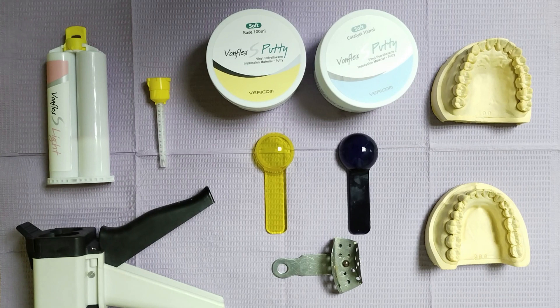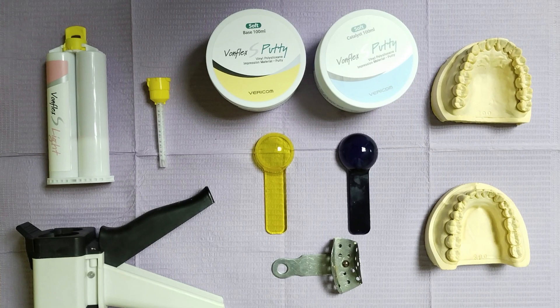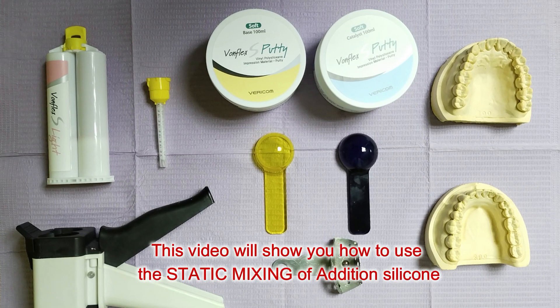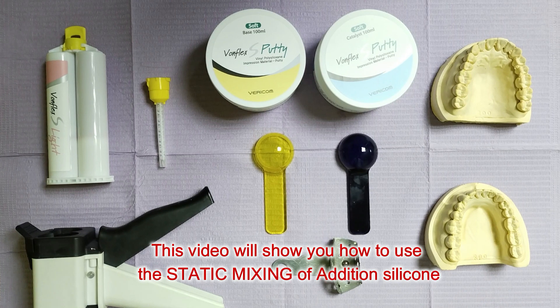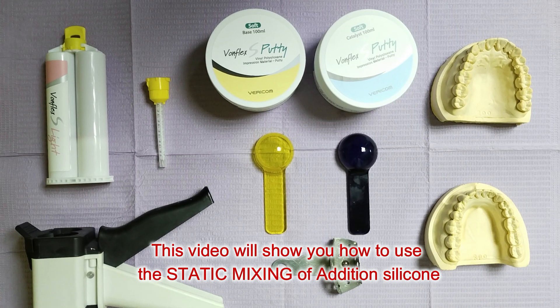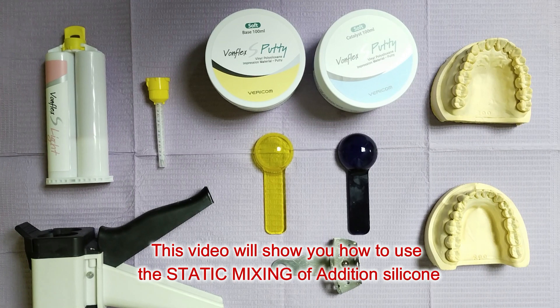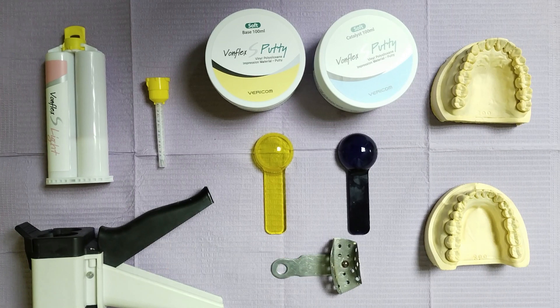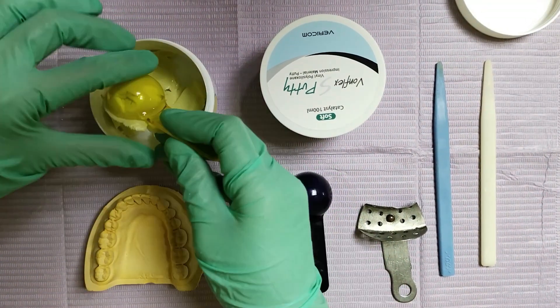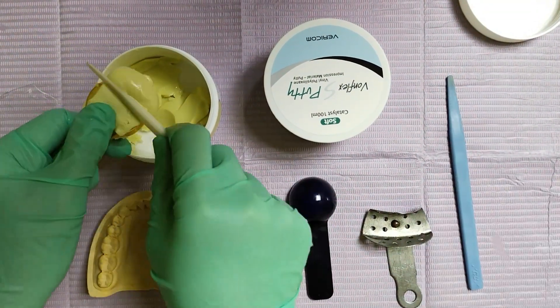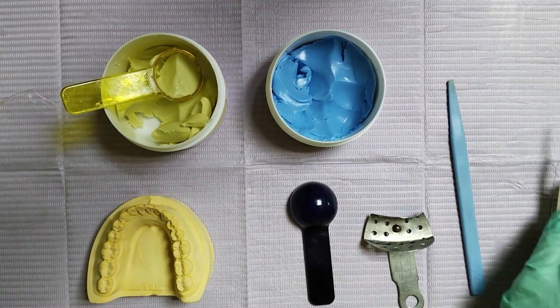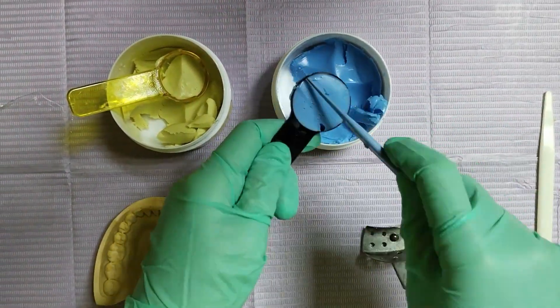For the hand mixing technique, you will use a glass slab or mixing pad and a metal spatula. For the static technique, you will use the impression gun and its disposable tip. Measure out the putty for your tray, which is half of a scoop for our partial impression tray.